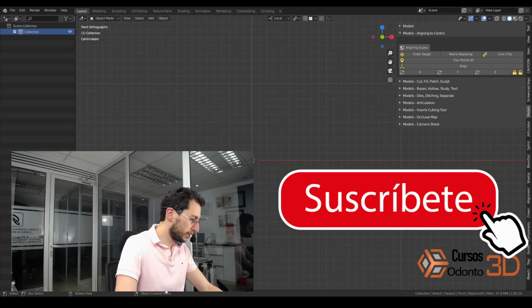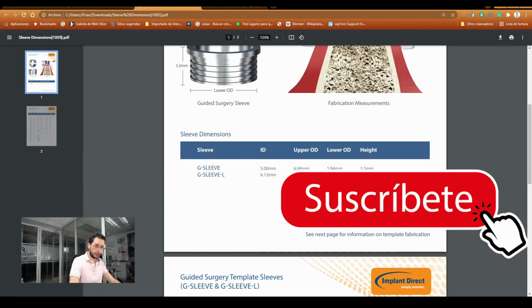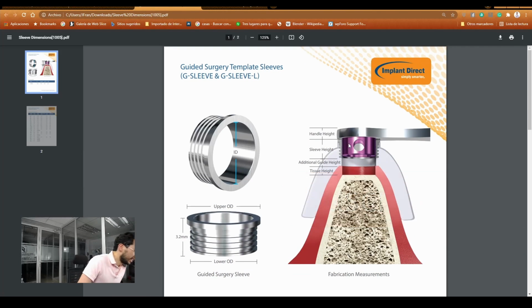So I have here on my screen a catalog of a company called Implant Direct. And these are the metal sleeves I need to design, and these sleeves are used as a guide for the drill, right? In order to have a proper perforation.